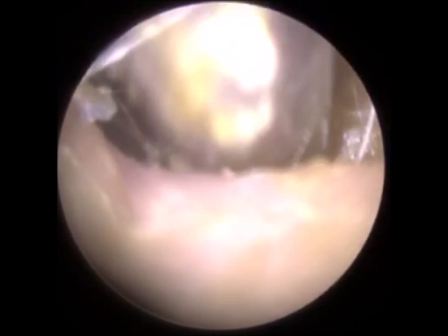So you'd be quite amazed at the end of the video when I show you all the still images. So you can see there, that's the medial part of this mastoid cavity, very deep in the ear. So that's all clear now. So this plug that we're working on now is just as you enter his ear canal, on the left hand side, right near the entrance. You can almost say it's behind the door. So you open the door, behind the door, it's hiding away. It's a bit of a blind spot.